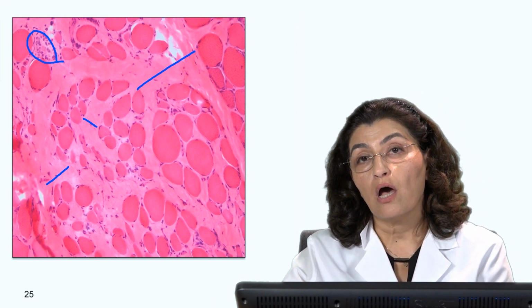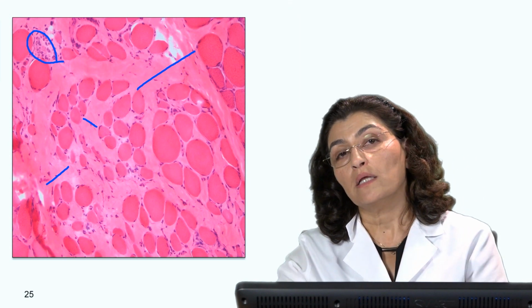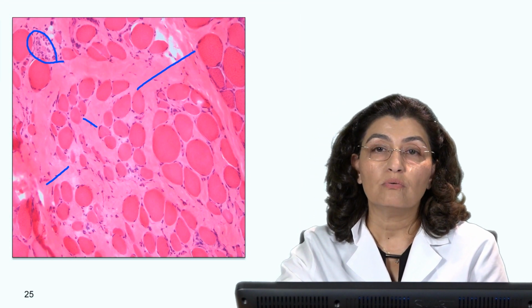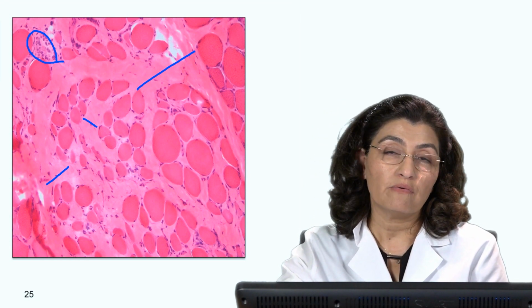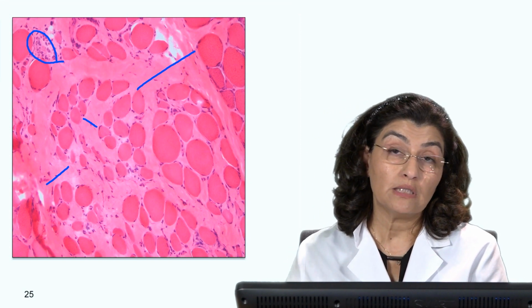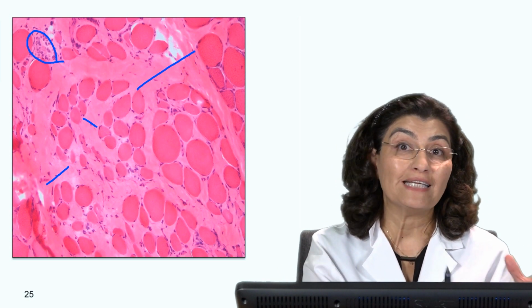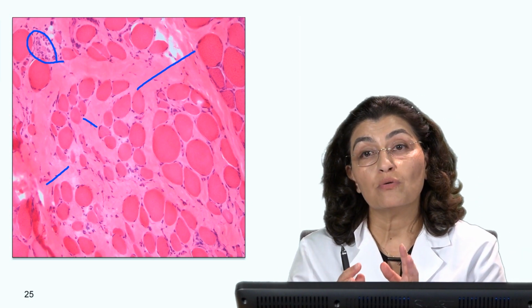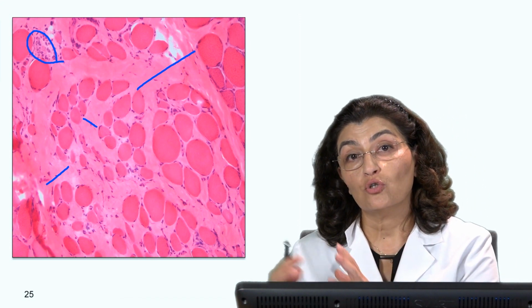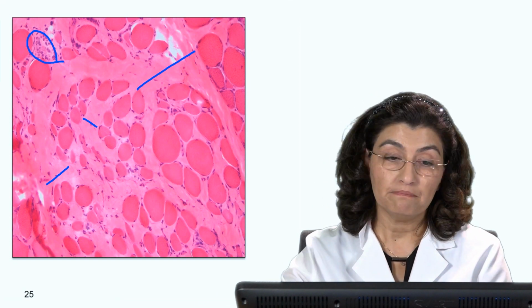End-stage muscle is not a very good muscle biopsy to read, because a lot of the time there is so much inflammation and scar tissue in it that the primary pathology is very difficult to detect. So the clinicians generally do not biopsy the weakest muscle, or the most affected one clinically. They try to choose a muscle that is weak, sick, but not totally lost, so we would be able to see the disease in action.